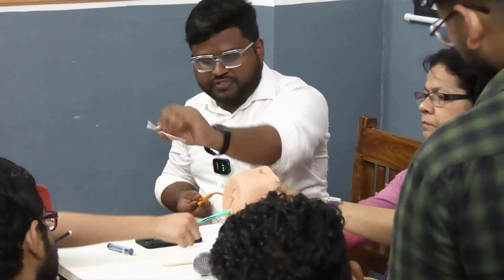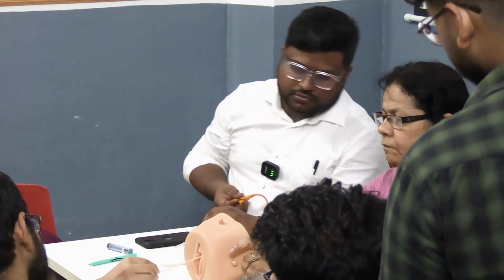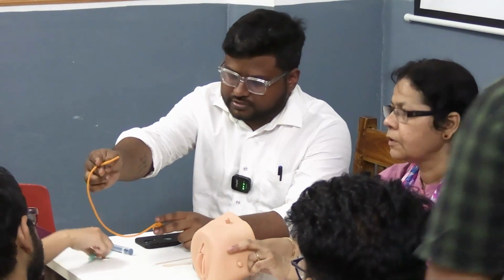Which is the urethra? Somebody show me the urethra. Point with this. Somebody show me the urethra. Yes, right, that is the urethra. Okay? You're going to insert.